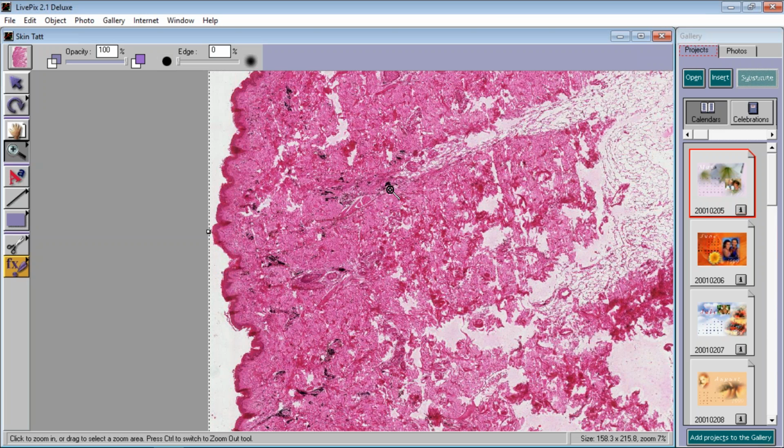What's another exogenous pigment that can be chewed up by macrophages? Well, how about the soot or the smoke particles or the anthracotic particles that you breathe in the air? Aren't they chewed up by the macrophages in your lung also? And can't they go to the pulmonary lymph nodes and other lymph nodes? And they could make the lung lymphatics, especially the subpleural rich lymphatics, look black.